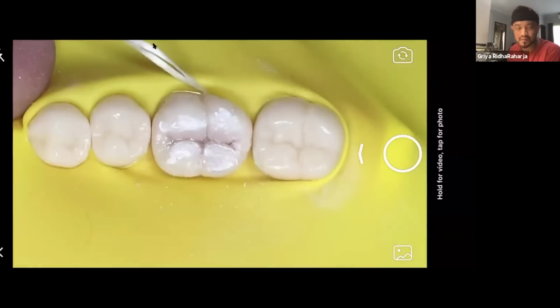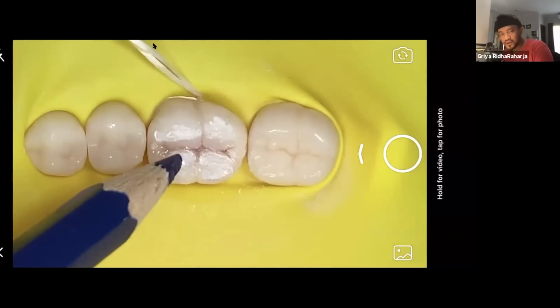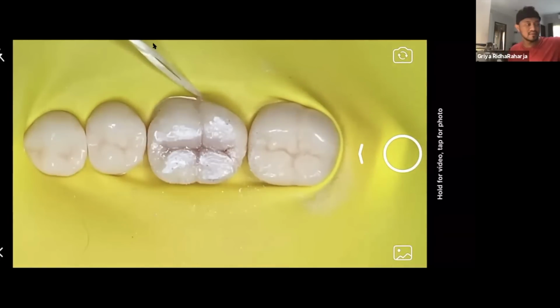Okay, done. And then recheck again. If they have, oh doctor, just a little bit, maybe in here or here. Just repeat like that. And then after you bite again, oh doctor, there is no overhang. It's already covered. Okay, so let's try polishing with rubber.